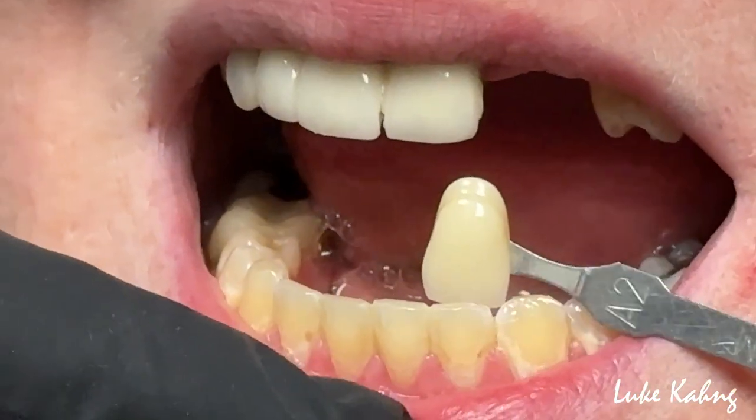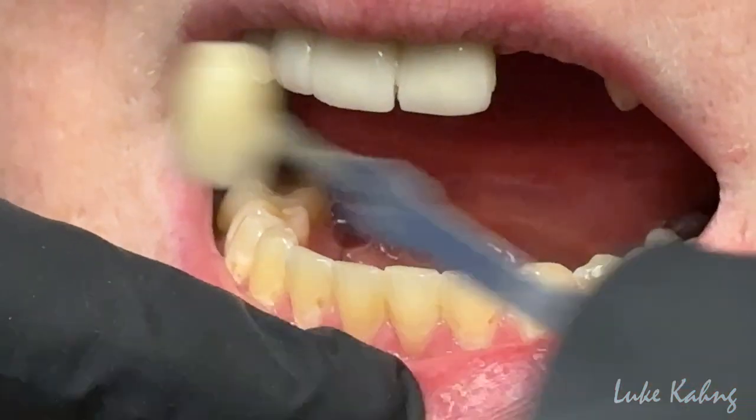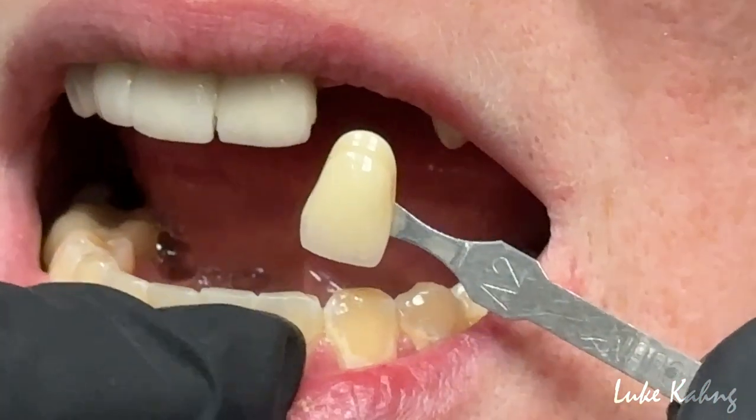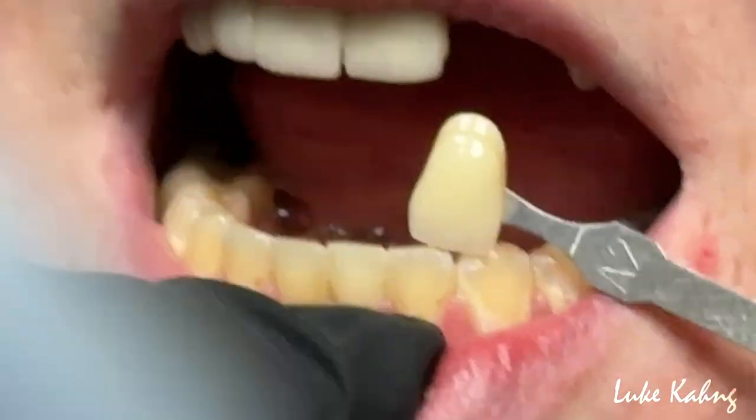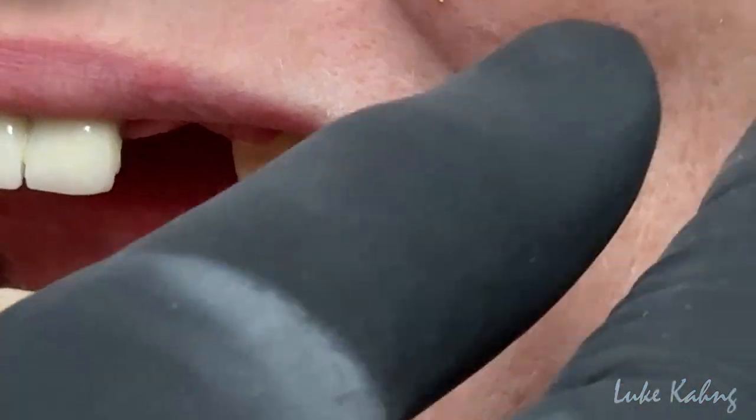I can apply with the enamels a slightly different aesthetic, just like that. So when matching here, slightly — okay, you see the differences? If I make this and then put just a little bit more of that characteristic. Okay? All right, now I'm going to take the photo.